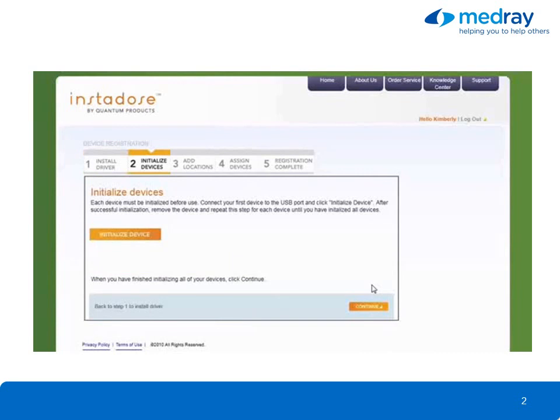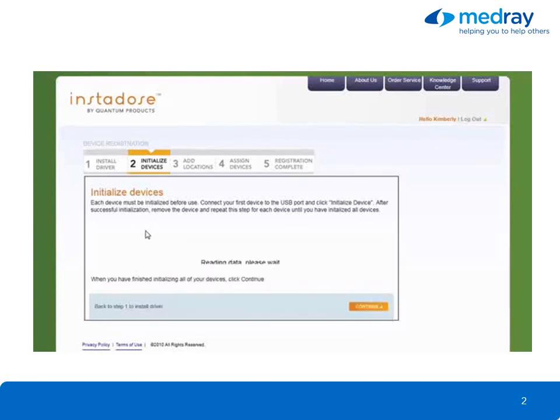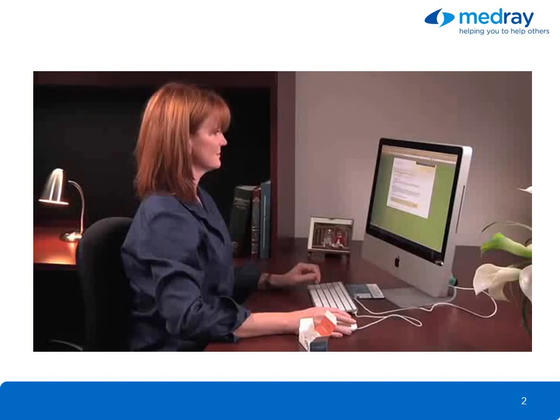Click Initialize Device. All InstaDose devices must be initialized before use. The initialization process removes any background radiation that the badge may have been exposed to during transit and sets the baseline for future reads. When initialization is complete, click Continue.